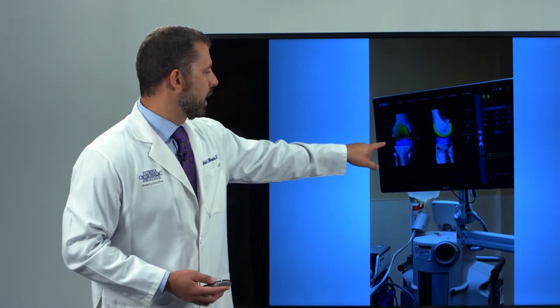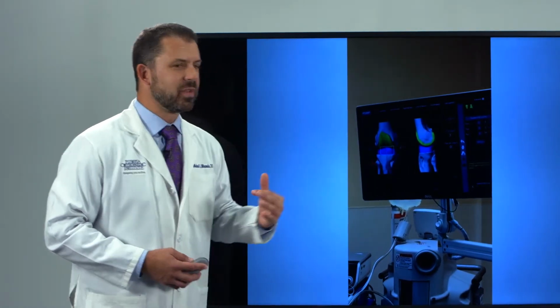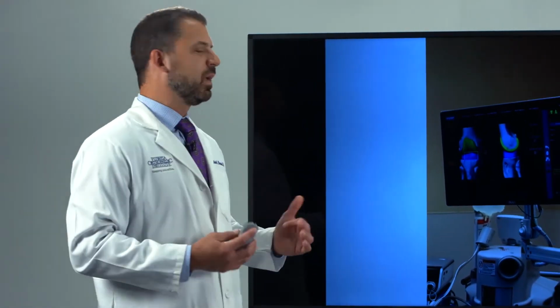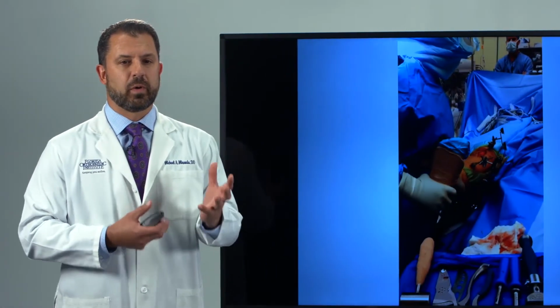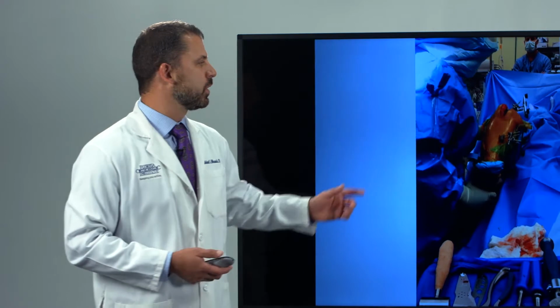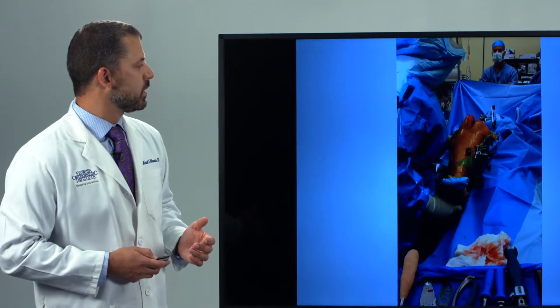Well, here's 19, 20 millimeters resection. When you stretch it, 21, 22. So the gaps are very well balanced within a half a millimeter to a millimeter. And you get your feedback from when your hands are on examining, and then also the computer feedback. So it's kind of a check and balance type scenario.